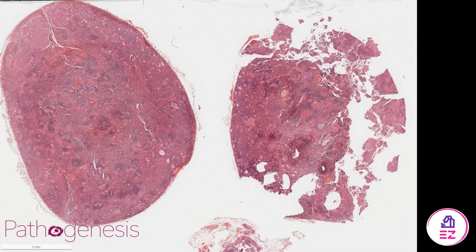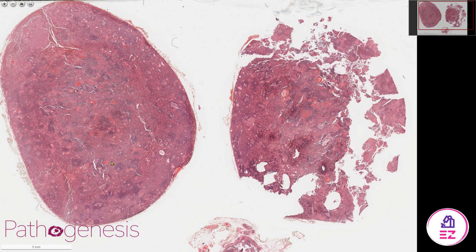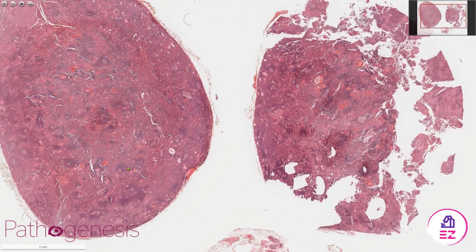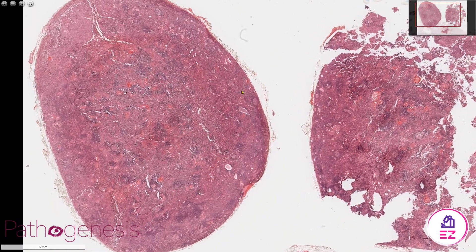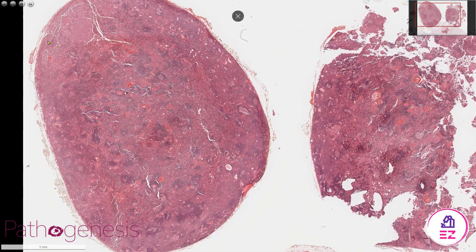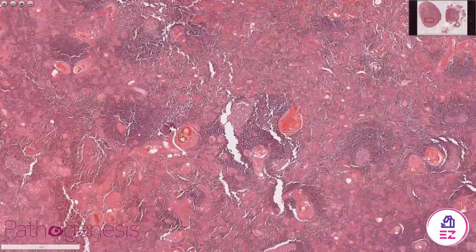Hello and welcome to Path Made Easy. Today's example is a sebaceous lymphadenoma, which is quite a rare tumor with some nice features to help diagnose it. We're going to focus on this slice here, and you can see that in keeping with its benign nature, it's very well circumscribed.